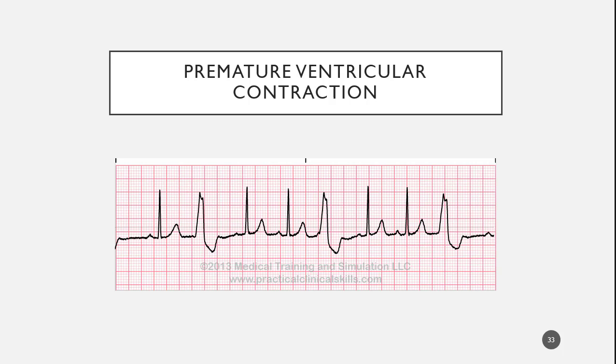We call it frequent PVCs. That was a loaded question. So every fifth beat would be frequent PVCs, and you would make a note of it in your documentation that it appears to be occurring after every fourth beat. Okay. So again, trigeminy is typically as high as I want you to be really, really familiar. So if you get up to it and it's quadrigeminy, just tell me it's frequent PVCs, and whether it's unifocal or multifocal.